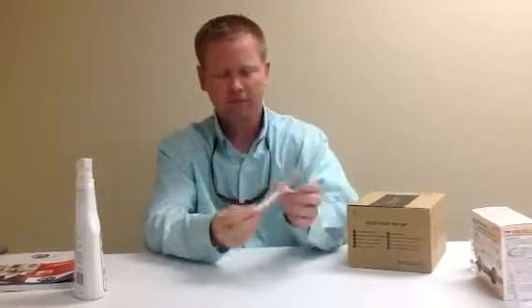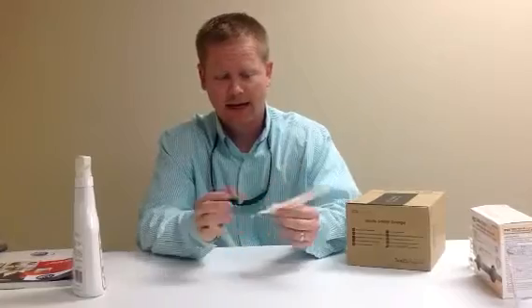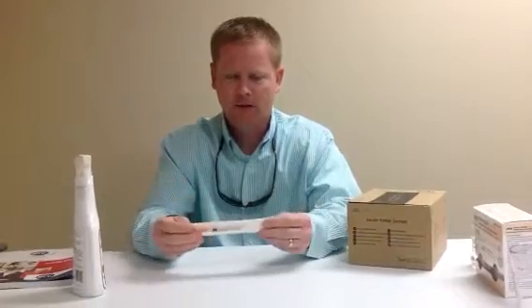You can also break the bottom of this off. I'm not going to take it out, but you can break the bottom of that off and it saves a lot of room for when you have to store them, for the containers, the sharp containers.